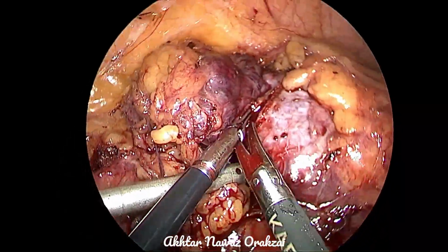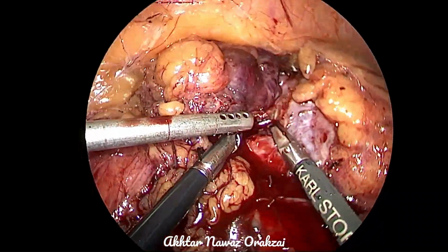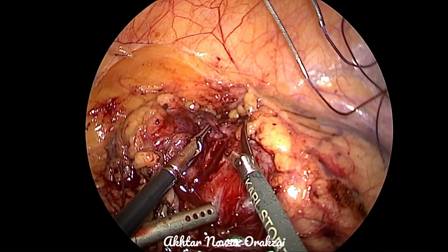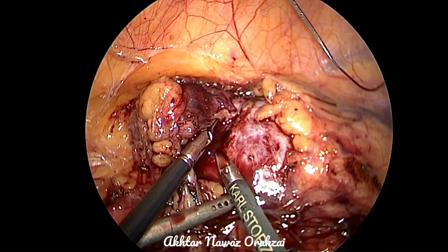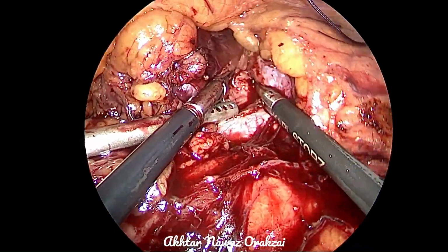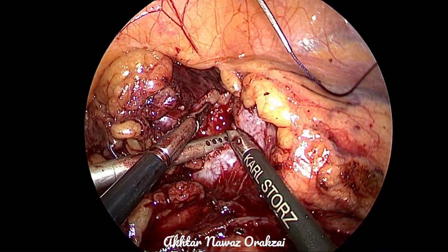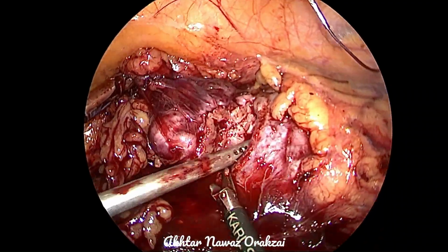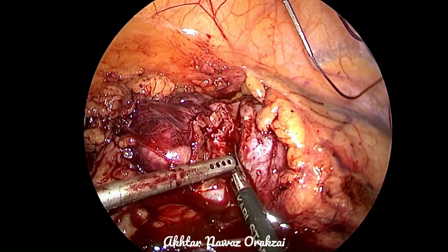So there will be a little bit of retrograde bleed, but there will be no arterial bleed, so we'll be able to work. What we are seeing here is the retrograde blood which is collected in the kidney, but as we dissect the tumor, the kidney is getting emptied of blood, and then this bleeding will stop. After creating this cleavage line, we are placing the suction at an area where it is providing traction on the normal tissue, normal kidney, as well as cleaning the area.